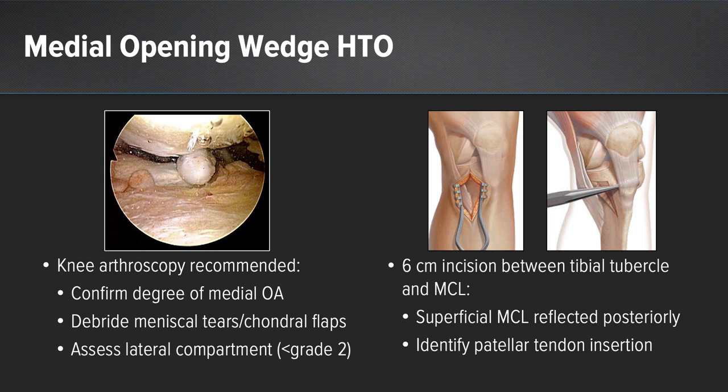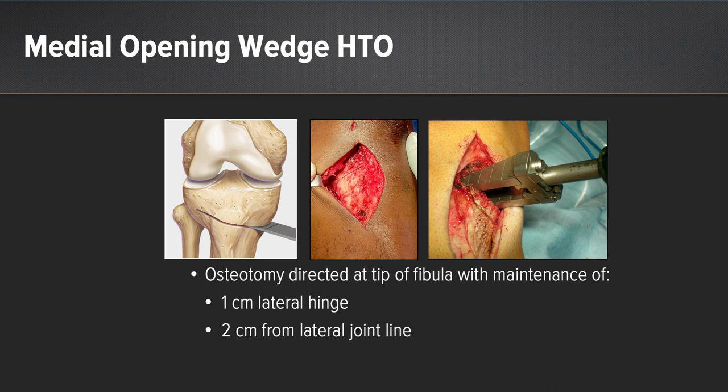A 6 to 7 centimeter incision between the tibial tubercle and the MCL is performed just distal to the joint line. The superficial medial collateral ligament is reflected posteriorly. It's important to identify the patellar tendon insertion because the osteotomy will be maintained above that location. When performing a medial opening wedge osteotomy, the osteotomy must be directed at the tip of the fibula in order to maintain at least 1 cm of the lateral tibial hinge, 2 cm from the lateral joint line, preventing iatrogenic fracture of the lateral tibial cortex or fracture propagation into the lateral compartment.